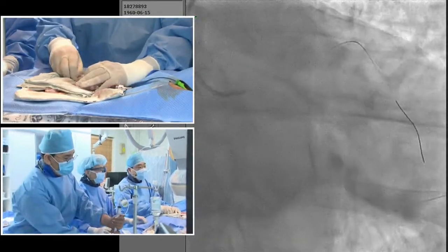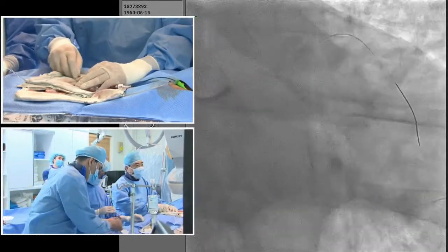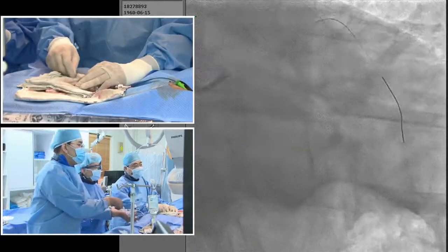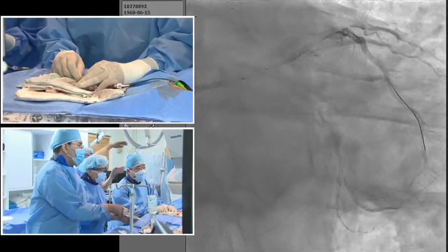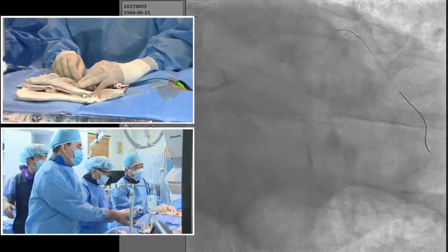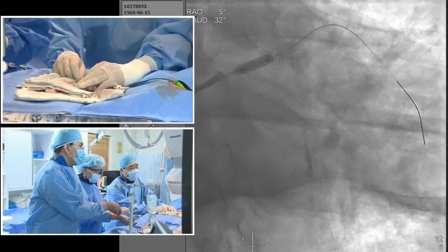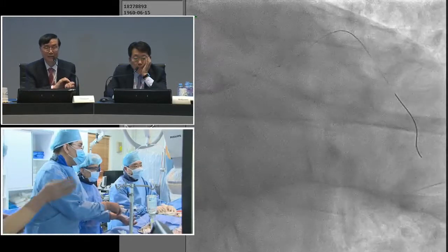This radial snuffbox function is very convenient for patients, so it's very useful currently in our cath lab, even in left intervention. Yes, we've done the snuffbox approach for full STEMI patients, and we used the glycoprotein IIb/IIIa inhibitor and the new P2Y12 inhibitor loaded. After PCI, there is no hemostasis complication in the puncture site. And we can save the radial artery even in CKD patients undergoing hemodialysis.